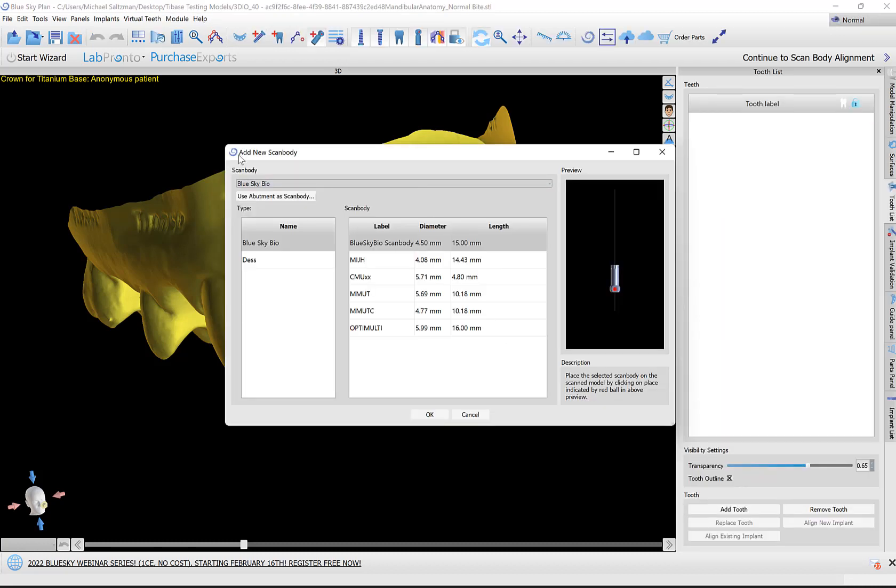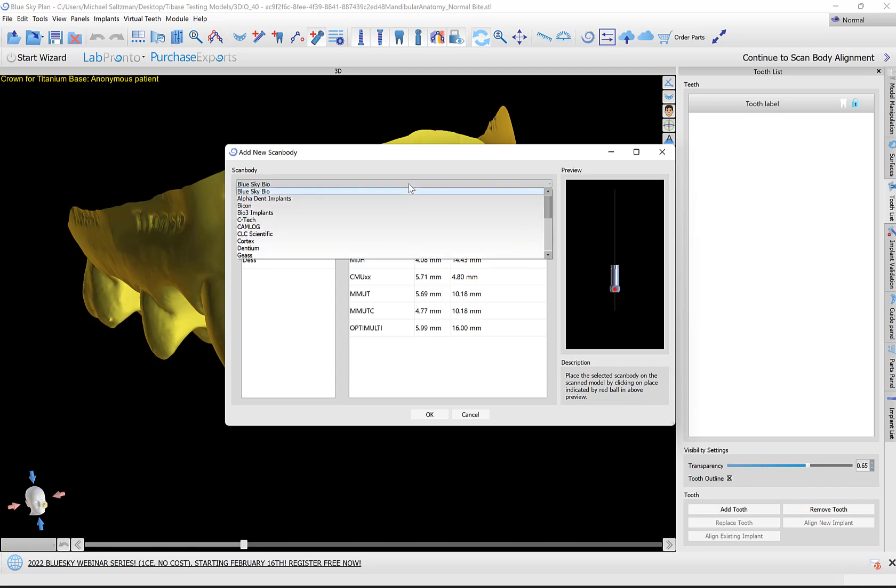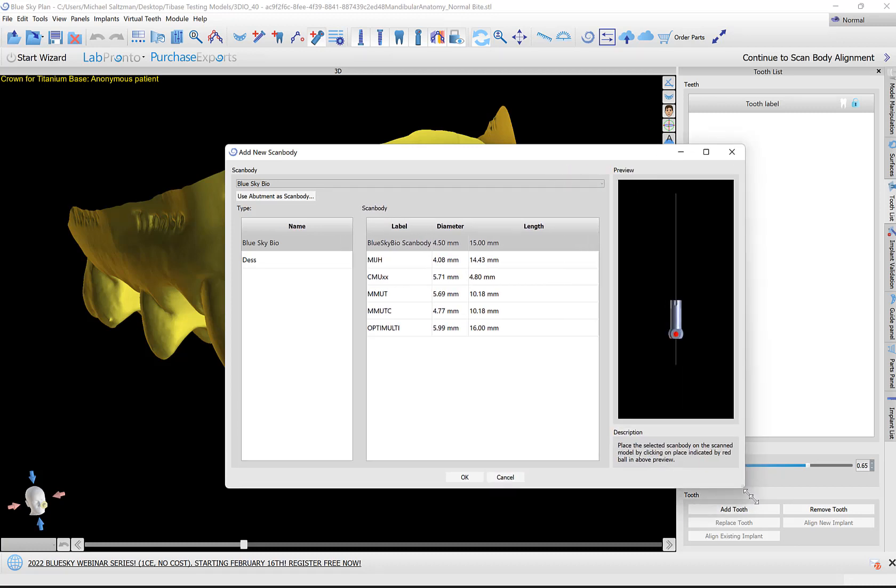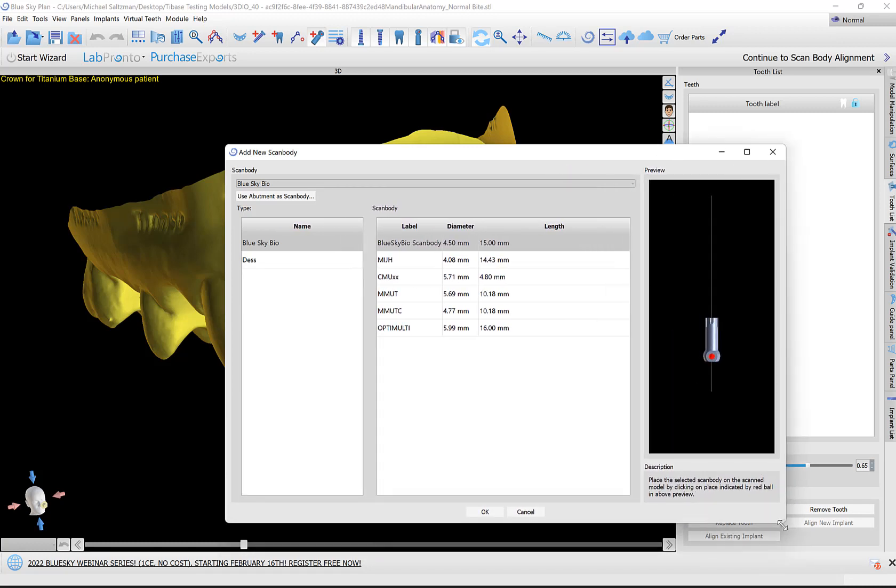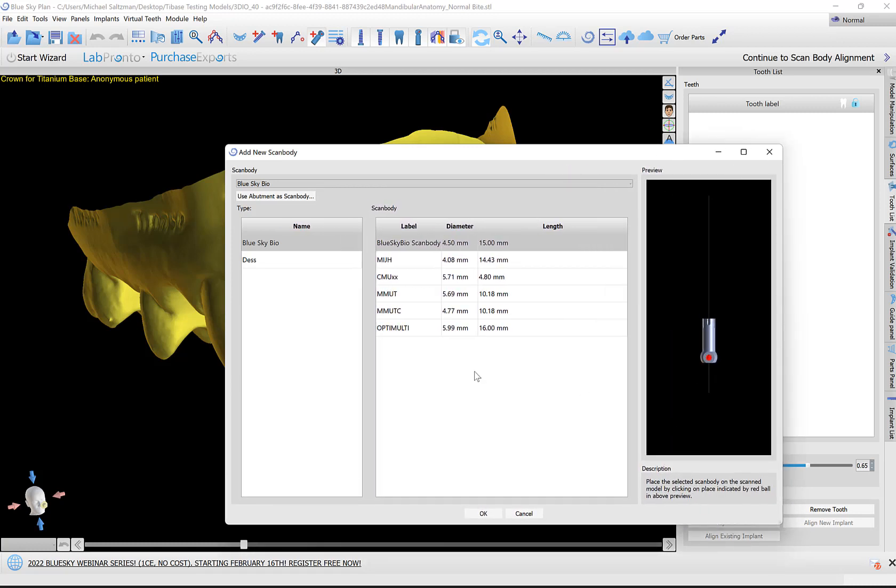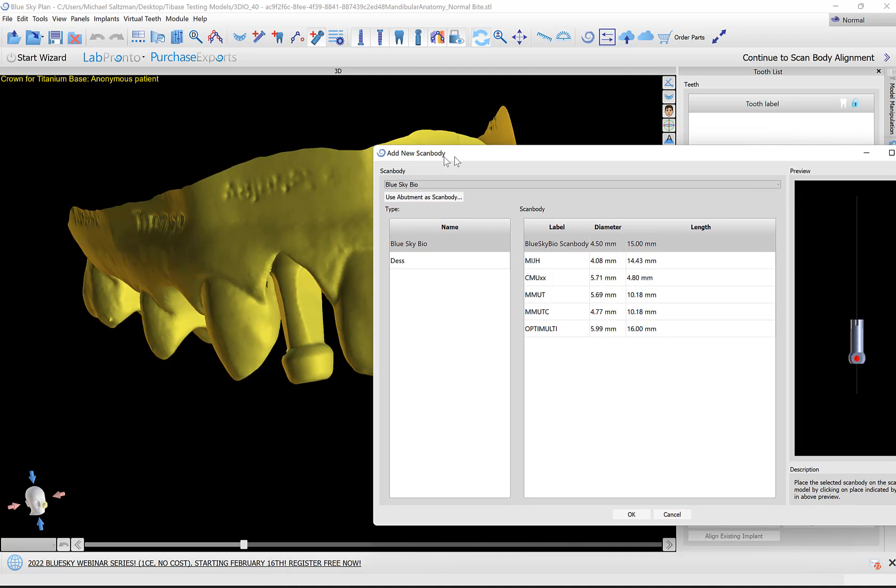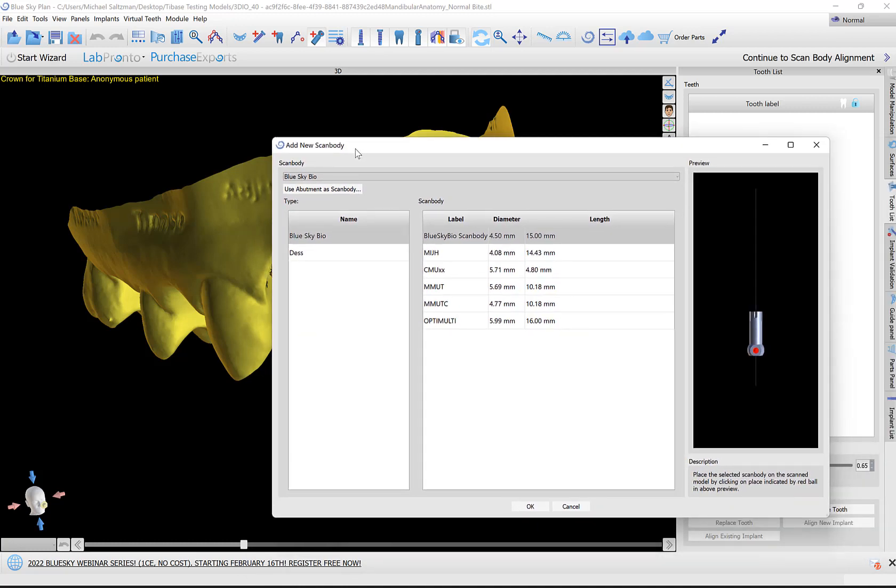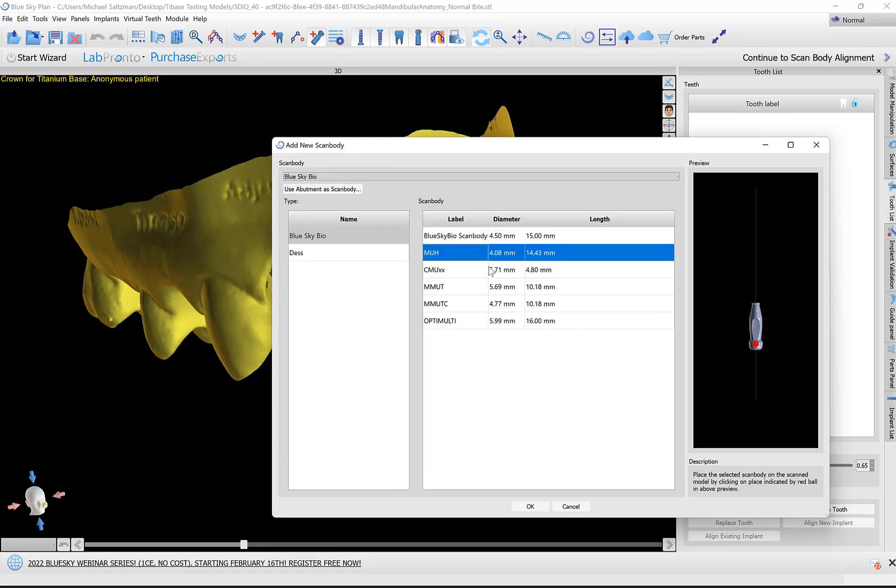We have our scan body library here. We have a drop down of the various companies for which we have scan bodies. If the company you're looking for does not show up on the list, simply contact us. Make an introduction. We'll add them to the software as quickly as possible. We also have a button here to use abutment as a scan body. So if there wasn't a scan body in the patient's mouth, just an abutment, you could select the relevant abutment from the abutment library and use that as the scan body.